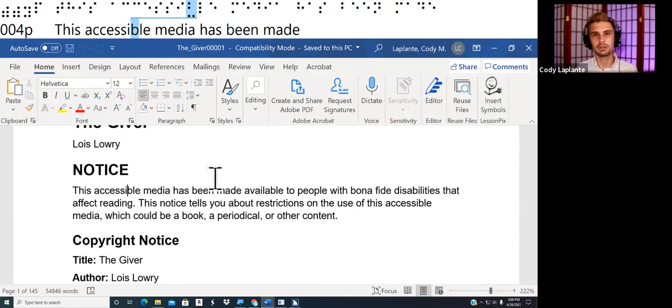But your BrailleNote Touch can only do that on certain apps, whereas your Braille display has the power of your entire computer, right? I tell my students all the time that if you are an employee and you go to a job and you bring a Google tablet and you say, this is the only thing I can work on, guess what? It's going to be really hard to be employed at a lot of places. Now you can bring your Google tablet to work and have that help you do your job, but you're probably going to be using a computer. Why? Because computers are super, super powerful. So this Braille display makes anything in Braille with the power of a computer, a real computer. Not a tablet, a real computer.